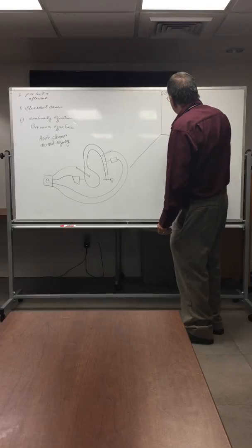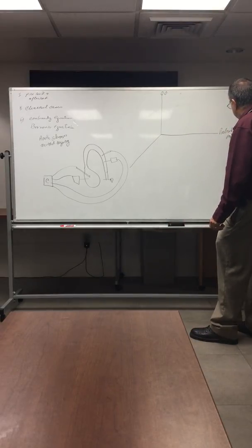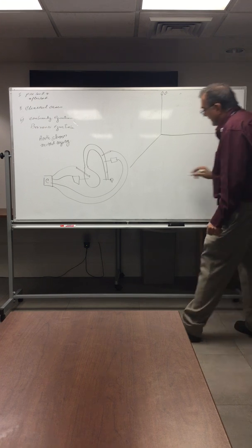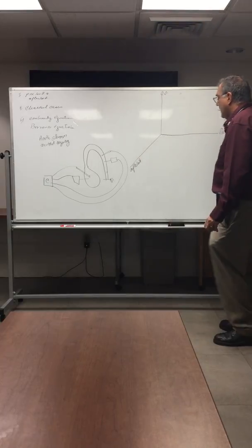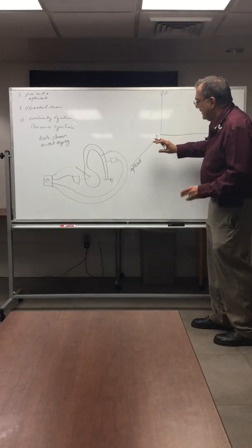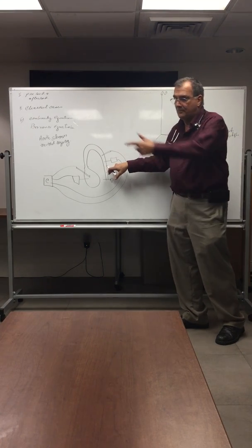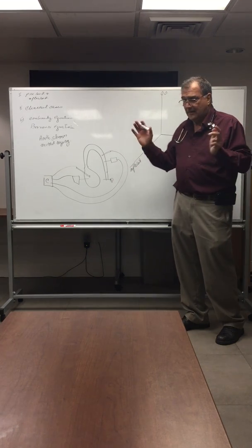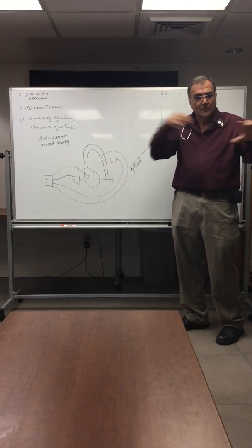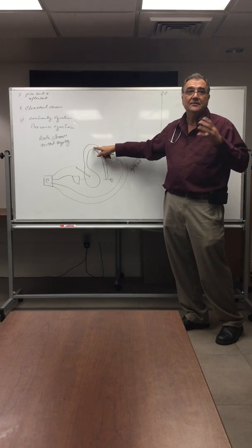Where cardiac output was here, this is the preload or the wedge, and this is the afterload here. Okay. Now, the first thing they did is they said, well, we're going to keep the afterload at 0. So when the heart contracts, they would tell the pump to draw out all the blood really fast, and it's a really fast pump. As the heart was contracting, that pump was sucking all the blood out of the aorta, so the net pressure inside the aorta was 0.